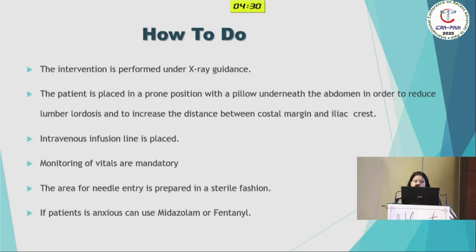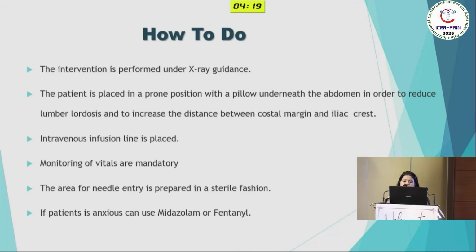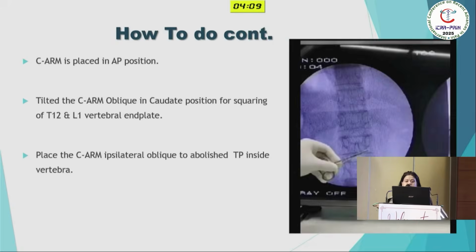How to do it? The intervention is performed under X-ray guidance. In my setup, I am using mostly the fluoroscopic-guided technique. The patient is placed in the prone position. Intravenous lines are kept and monitors are attached to the patient. You have to be prepared for any drastic problems.